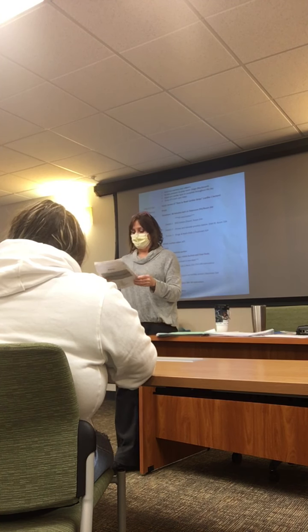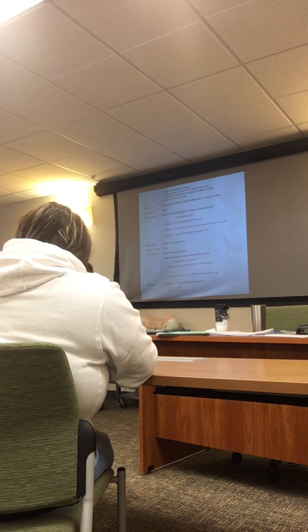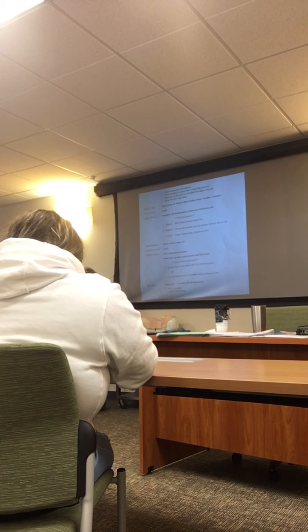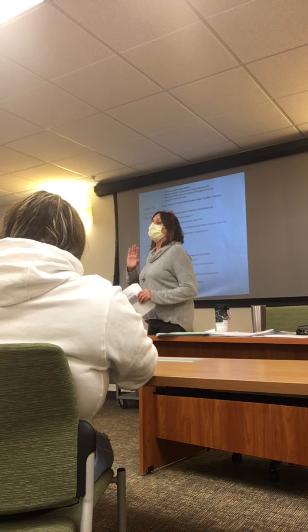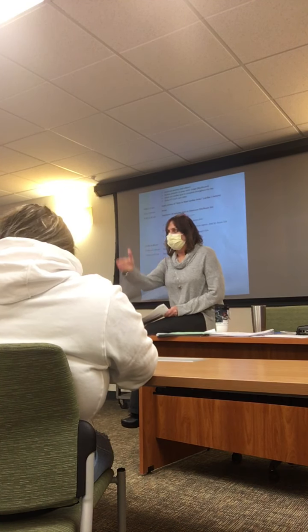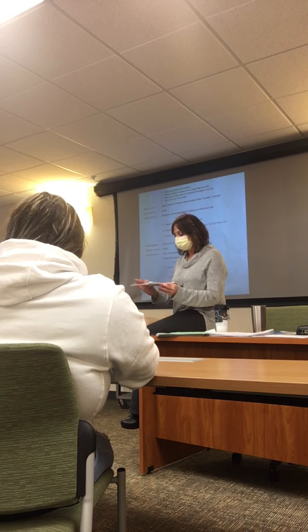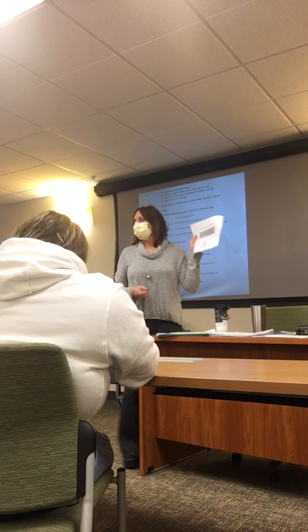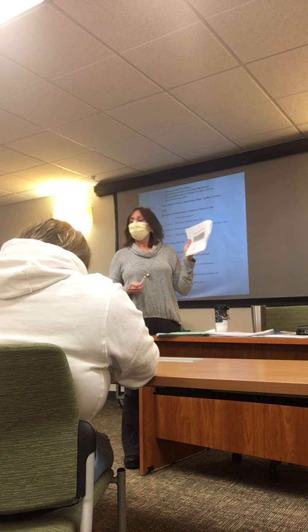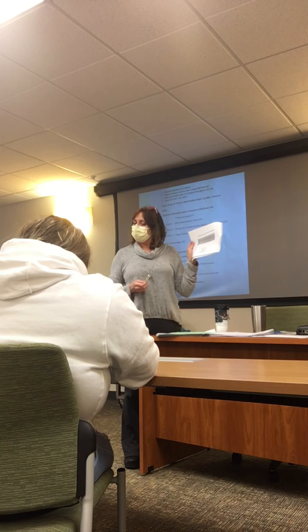All right? All right, this next rhythm here, PVCs. This is what you were talking about, I think. This is where I have an underlying rhythm, but I have an early beat. And I can have quadrigeminy, bigeminy, trigeminy, depending on how often it happens. So let's look at this strip. Are there P waves? Do you see P waves? How about QRS complexes? Yeah. Can I measure a PR interval?